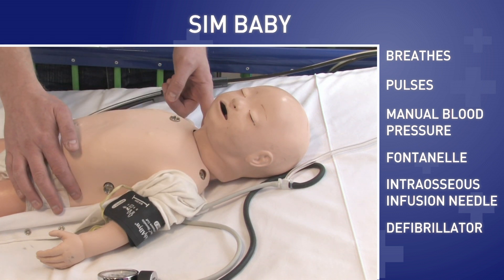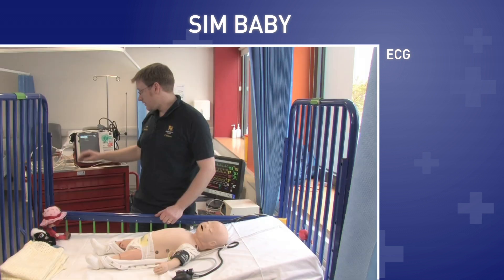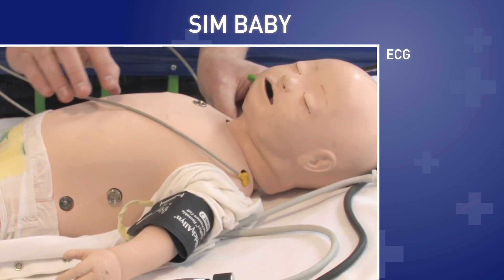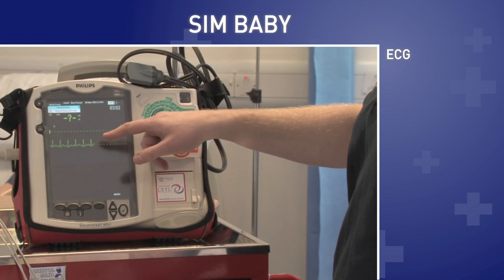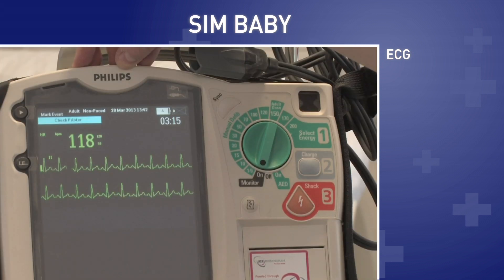You can also put a real monitor on him which gives a real ECG output. So if I put the ECG leads on, Simbaby will be able to get a real rhythm on the monitor. You can see the trace coming up here, and it has also now picked up his heart rate as well.